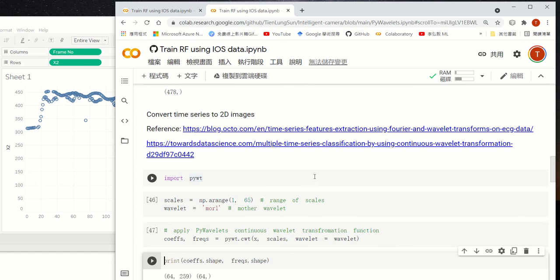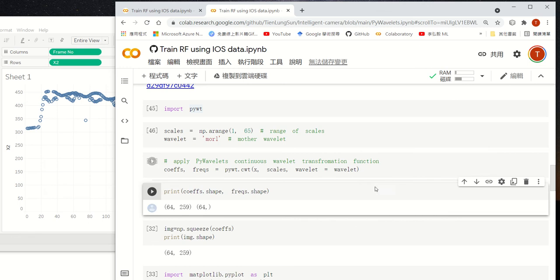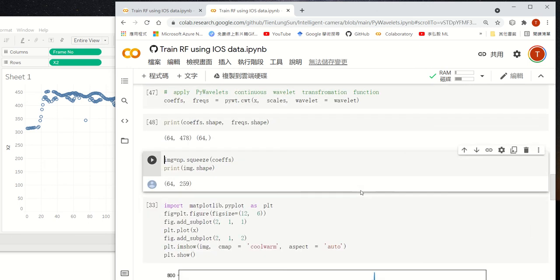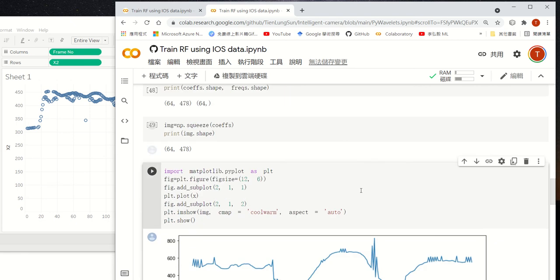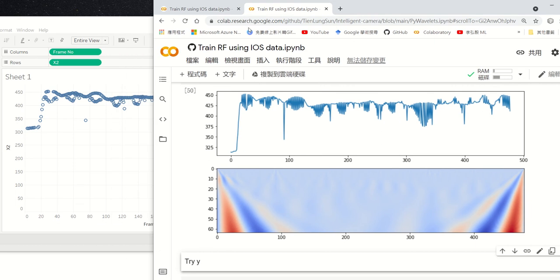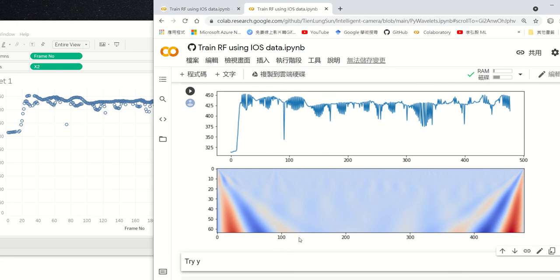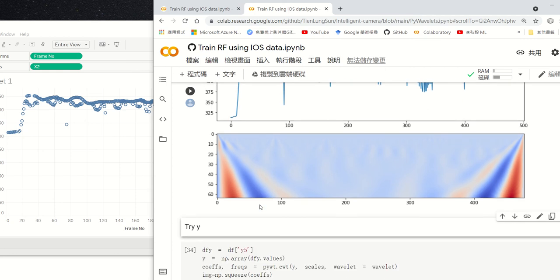For more details, I will ask Jiaxuan, Shihai, or Qihan to explain in our meeting. I will skip the details here. I just show you how to run it. Once we run it, we see the original time series as well as the 2D image of the time frequency picture. It shows you the same time scale and the different frequency scales of the energy, or the strength.